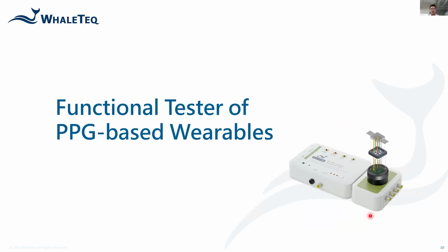And now this functional tester, the AECG 100, is positioned among all available test methods. The AECG 100 primarily originates from the concept of the functional tester in ISO 80601-2-61. To better understand where to apply the AECG in verification, let's go over the standard just a little bit.